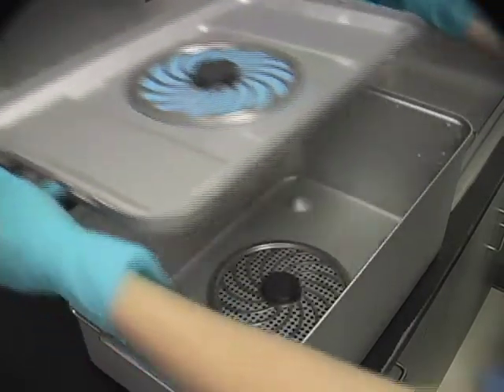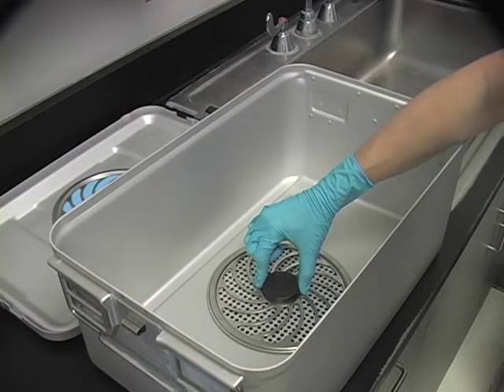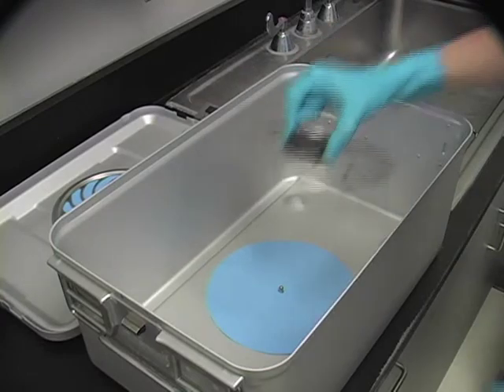When using filter paper with the indicator ink, be sure the indicator dot faces toward the inside of the container when the lid is in place, and the indicator dot is visible through the retention plate on the inside of the lid.